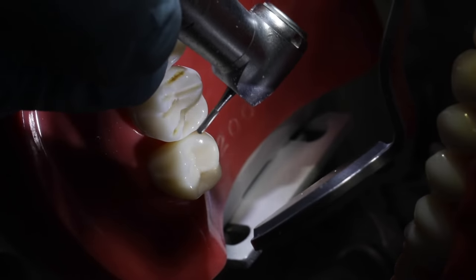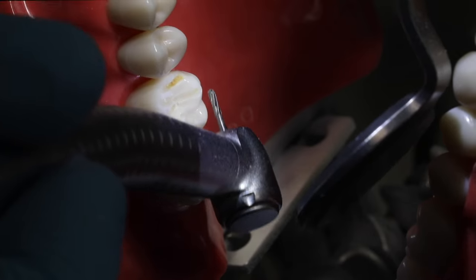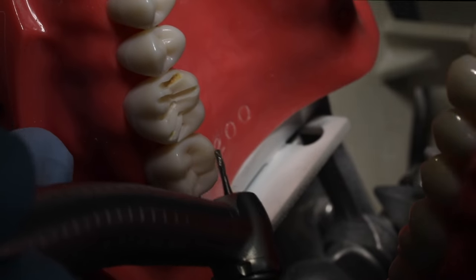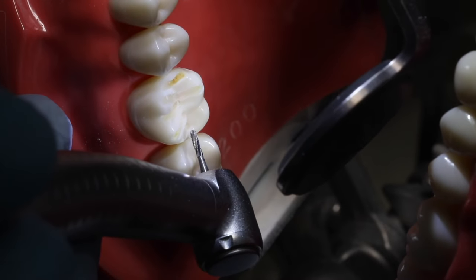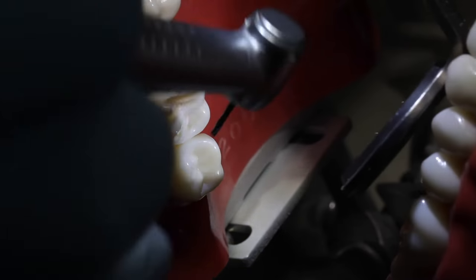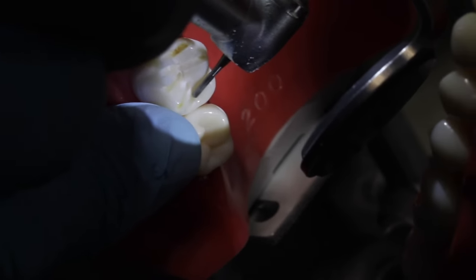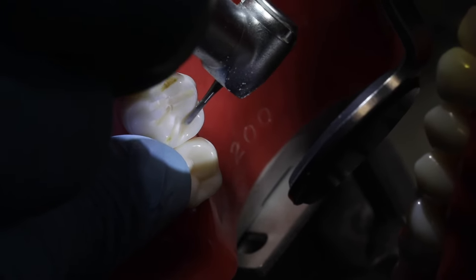Now we'll come back and we'll do the lingual groove, and that groove follows a very oblique angle. Going from buccal to lingual, it tends to migrate mesially. So there's a strong tendency when we place the lingual groove to straighten it out and make it perpendicular to the line of the teeth and just take it straight lingually. And that's not the shape of those teeth. It has a distal to mesial direction on it. So we want to make sure we maintain that. And we'll go back to that distal pit and put a guide cut right there.